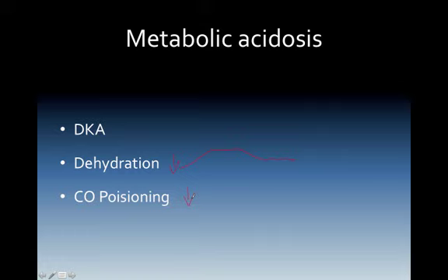Differential diagnosis for a person that might possibly have CO poisoning should be done with a machine that can facilitate if you have carbon monoxide present. This differentiation in the values should be taken into consideration for oxygenating your patient. Example of this, if the CO is 24% and the pulse ox says 100% and your end-tidal CO2 is low, there's a good chance that they're in a hypoventilatory state at the cellular level. Load them with some more oxygen. See if we can increase that end-tidal CO2 number.